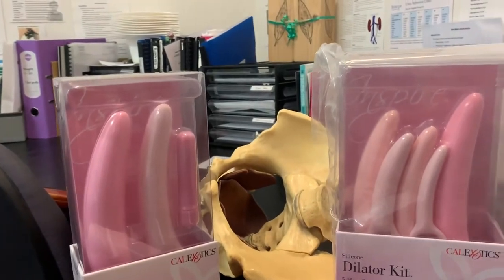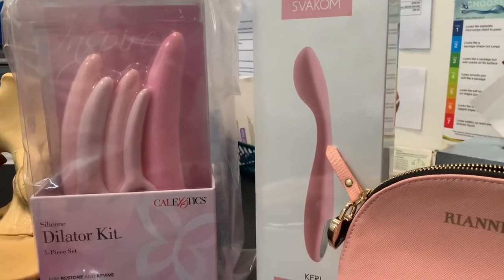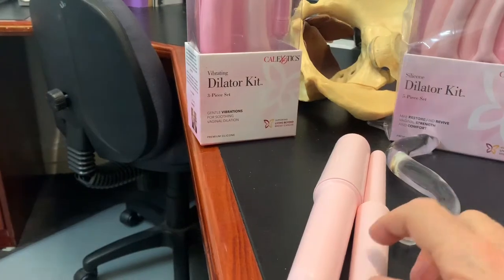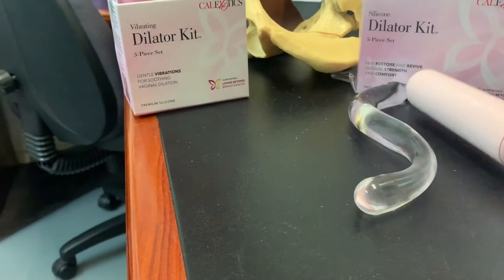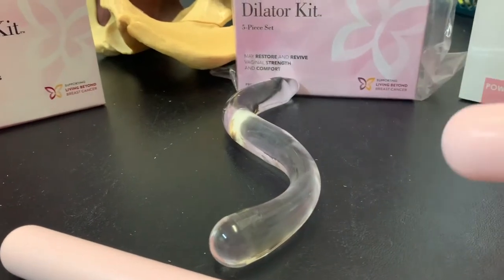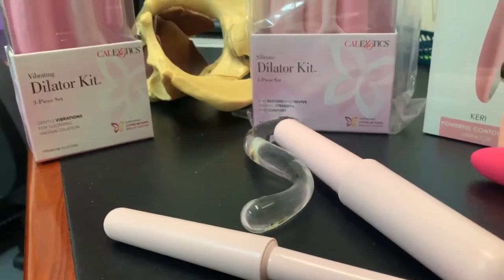So we've got a large variety of different trainers or dilators here at the rooms. This first one is a set of dilators called a Femax. The Femax come in four different sizes — a thin narrow one, which is very useful when we're going to be doing some massage of the muscles if they've got tender points in them, then size two which is slightly bigger, size three and size four. These are useful for doing what we call graded exposure.